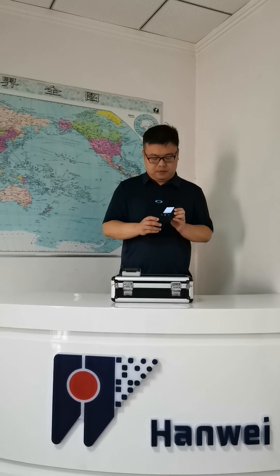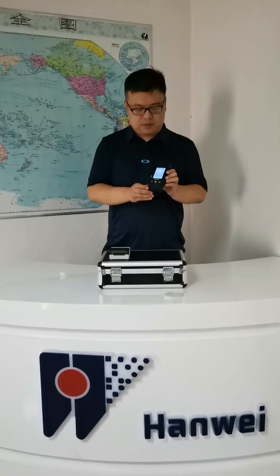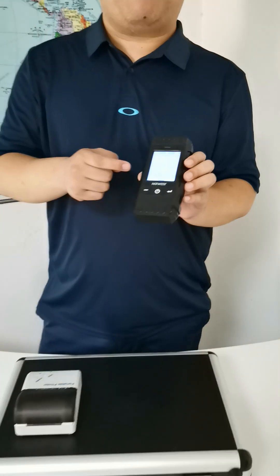First of all, power on the device. You can see there's a screening option here — I need to press screening. So you can see this one can be checked as a rapid check, very quick. This is the rapid screening.